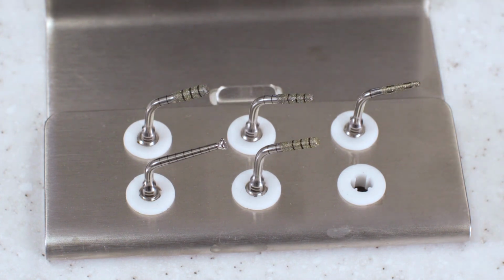So this is purely for internal sinus lifts, doing so safely, once again, by cutting with the diamond coated tips and then lifting with the hydraulic pressure.